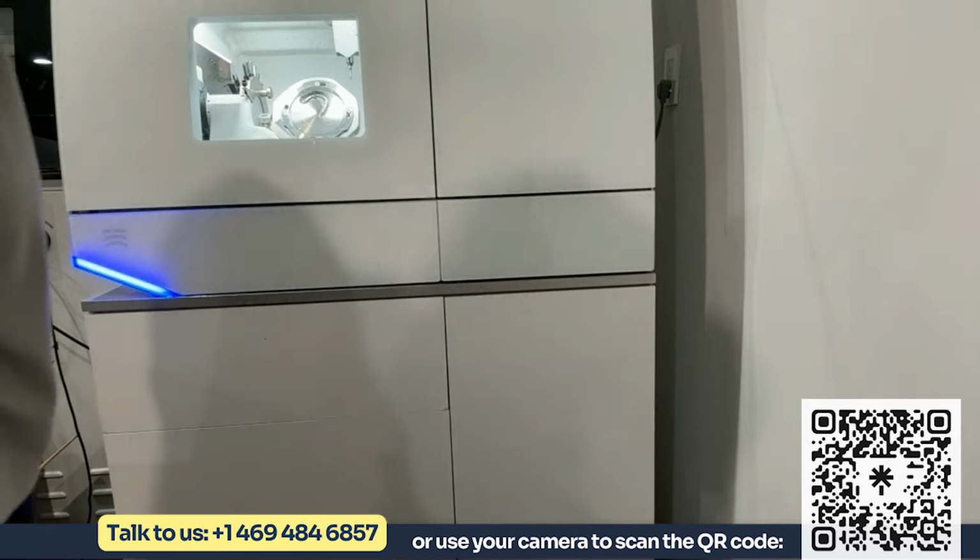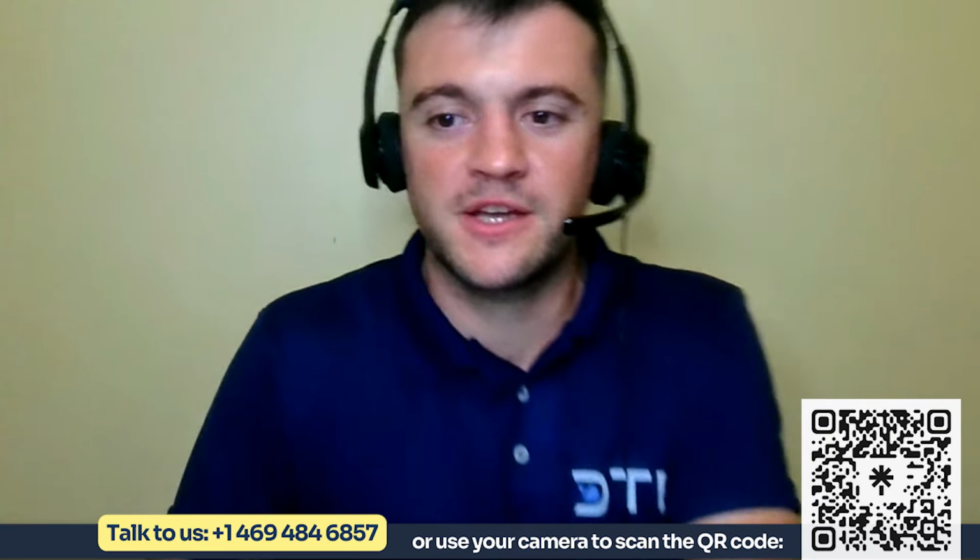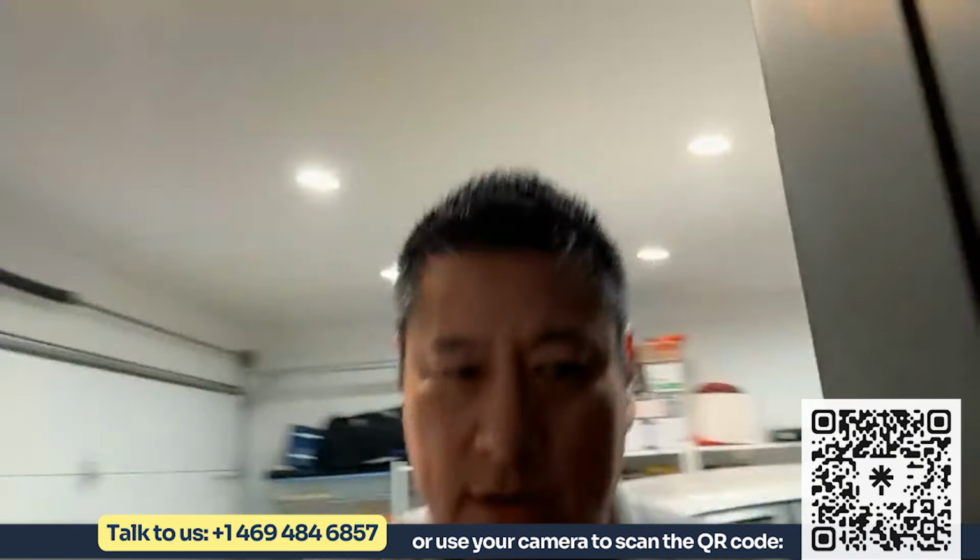Anything else? Let's just see if the simulation is done. Oh, it's done. I think we just cover the simulation and we hand it to Rebecca. Okay, give me 1 second here.